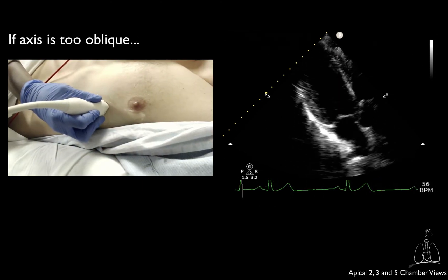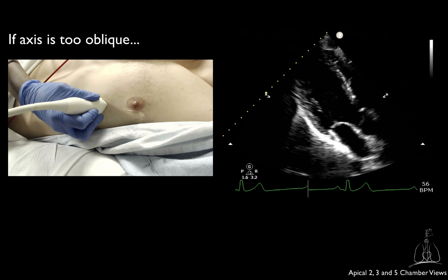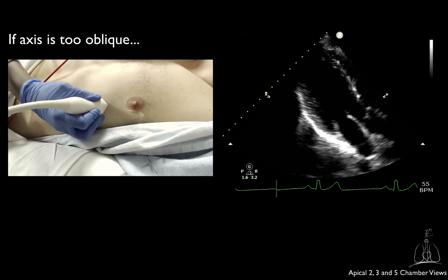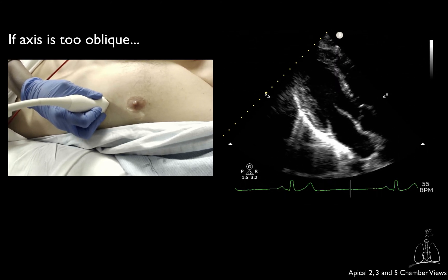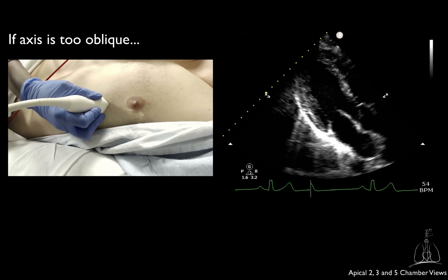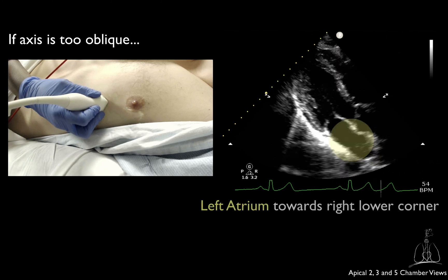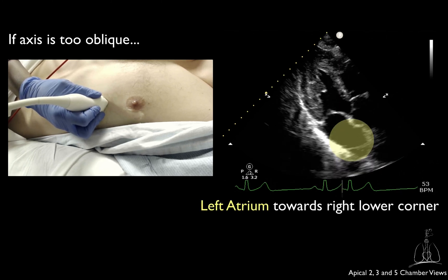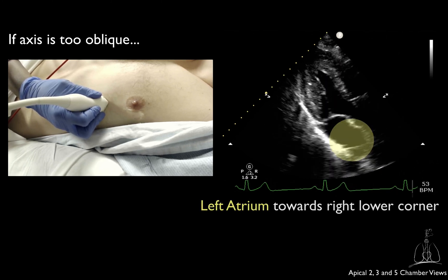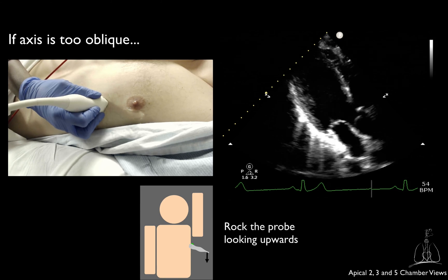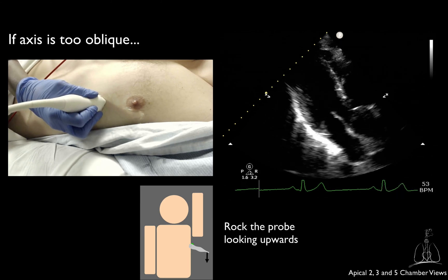Similarly, as for the apical 2 chamber, if the axis of your 3 chamber is too oblique from one side, usually with the left atrium towards the right lower corner of the screen, try to rock the probe looking upwards.